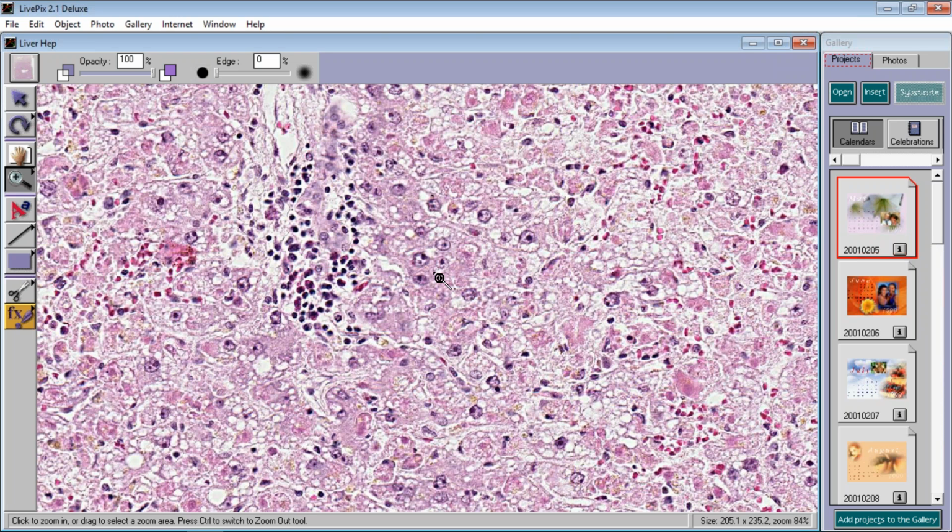So if you have a liver and it has inflammatory cells, how about if we call it hepatitis? And that's what this is. Of course, if it was even more severe, you might get this inflammation all over the liver. So just to keep things simple, we're not going to say this is due to a certain virus, or due to alcohol.